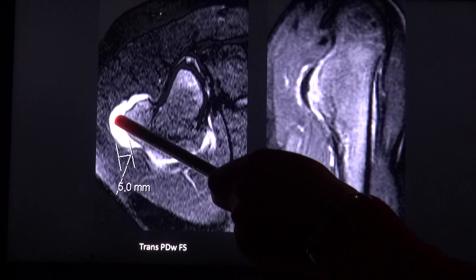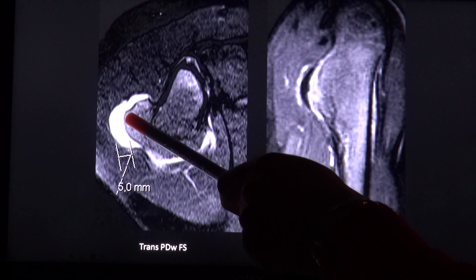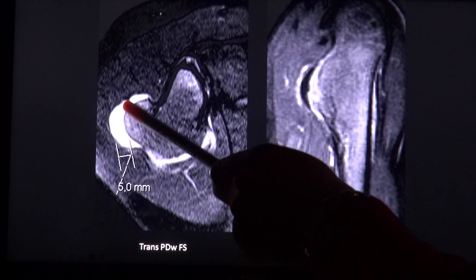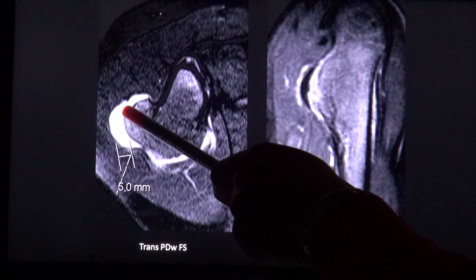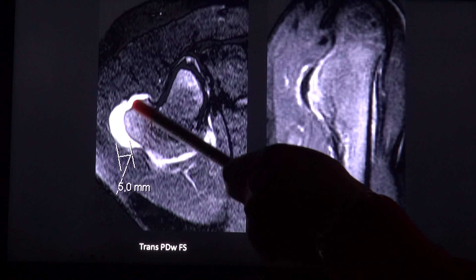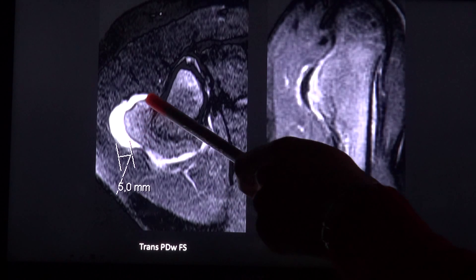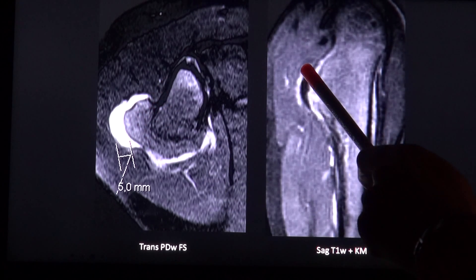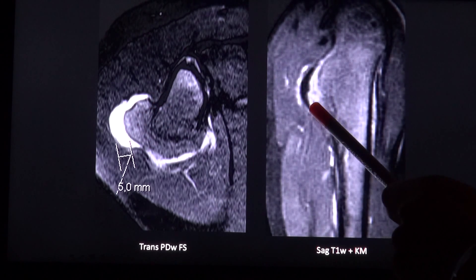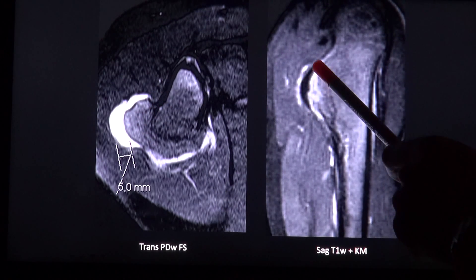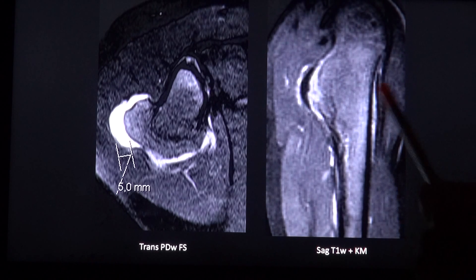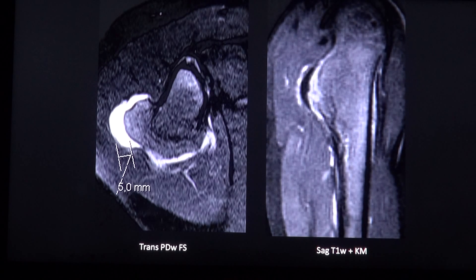Another example with the bright cartilaginous cap sitting on top of this lesion. After contrast injection you don't see any enhancement.